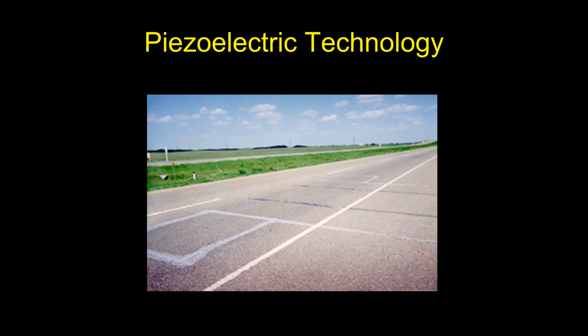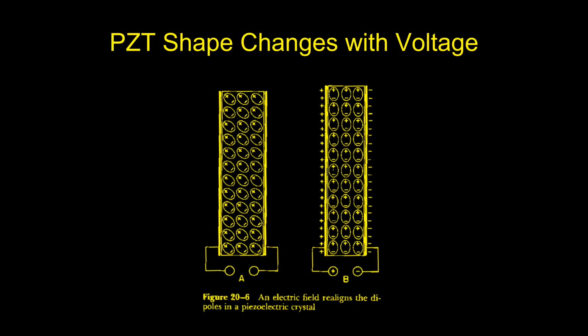Okay, so that's the real world example that has piezoelectric properties. Well, our ultrasound probe is the same thing. So what happens when I put an electric pulse on that crystal? In example A, there is no electricity supplied, and so that crystal has a certain length and width.